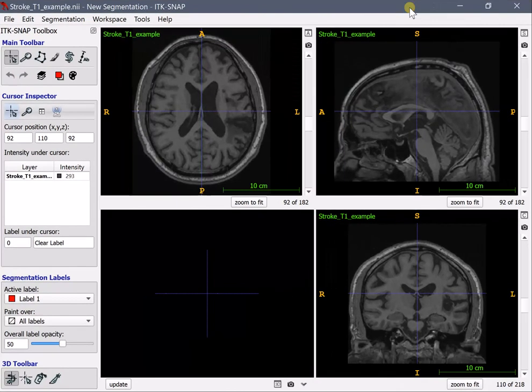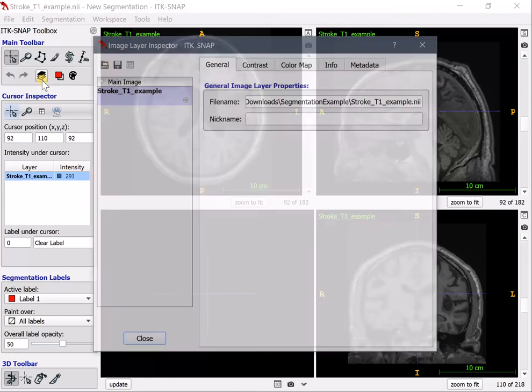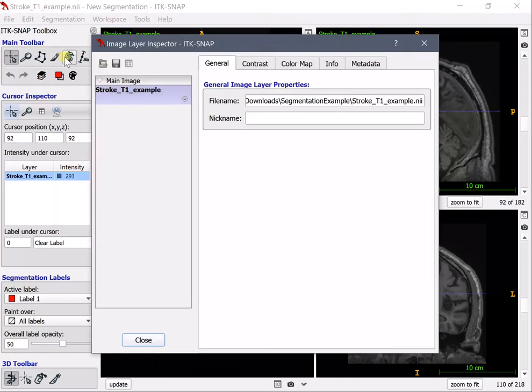If you have ITK-SNAP installed you can just double click it and ITK-SNAP will open. Now this is the graphical interface of ITK-SNAP. The first thing you need to do is reset the boundaries for the signal so you can brighten up the image a bit.